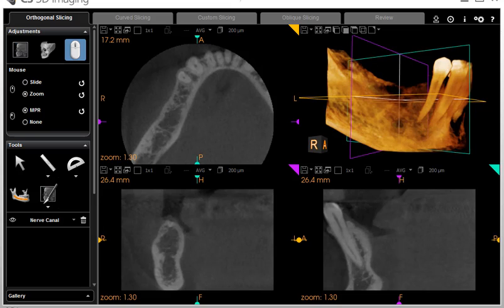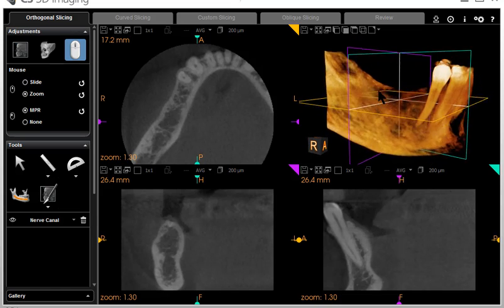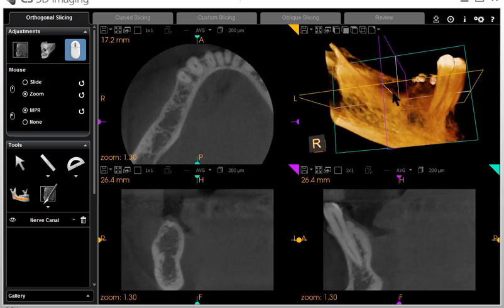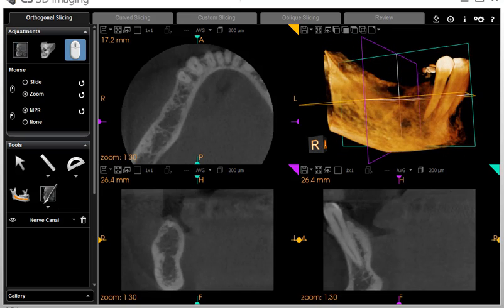I'm going to demonstrate how I use Kodak CareStream 3D imaging software to virtually place an implant. I'm going to start in the orthogonal slicing view. Just to get oriented, here is the 3D image. The three windows here are color-coded.